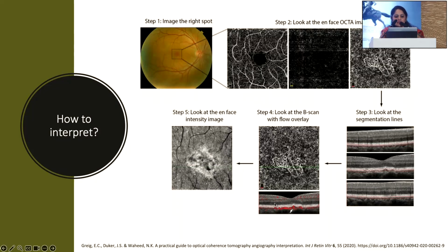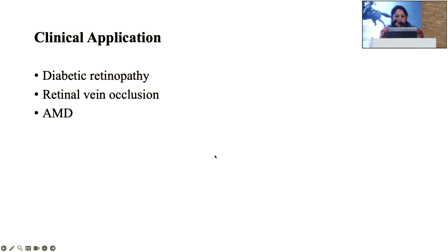You see that in the B scan also there are these irregular PEDs, and you see the flow below the RPE. This suggests that this might be type 1 MNV. And also the signal intensity is good, so there is not much shadowing artifact.